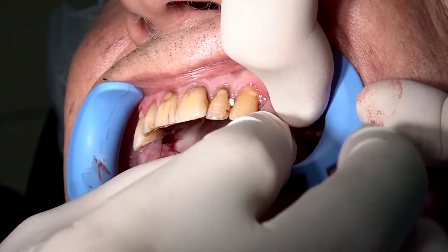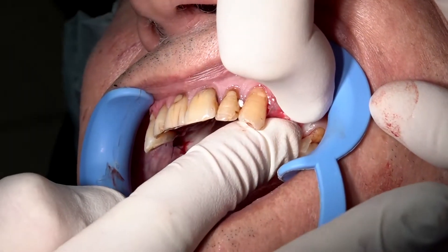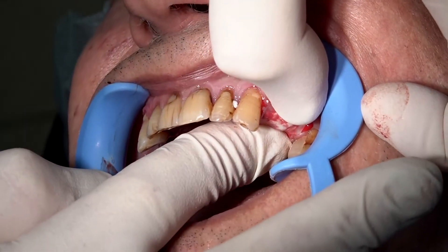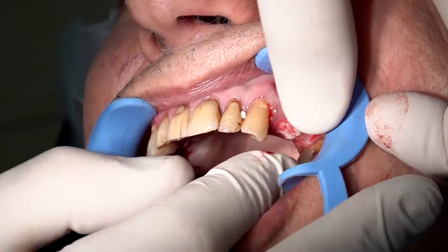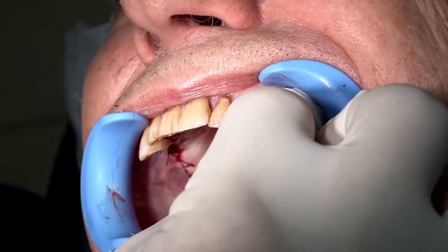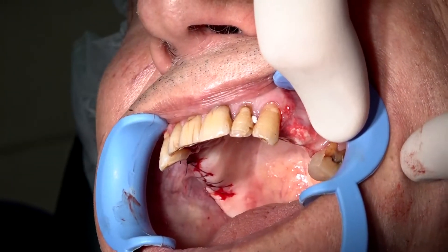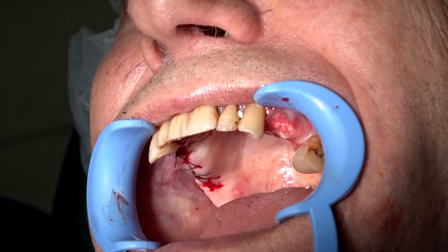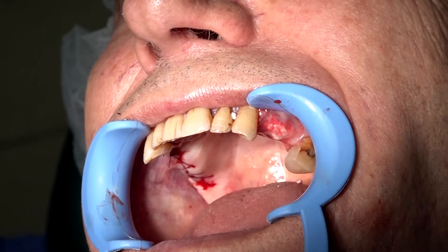We place it on the area and cover the exposed graft. As you can see, the band adheres to the gums. Now we must secure it with sutures. Otherwise, it will fall after 4 hours.